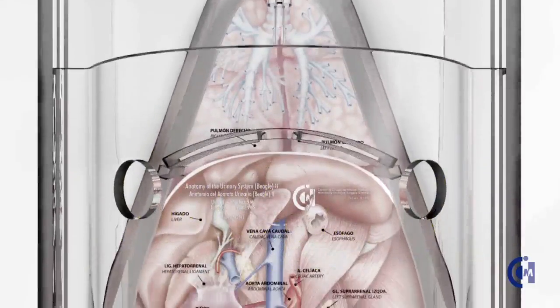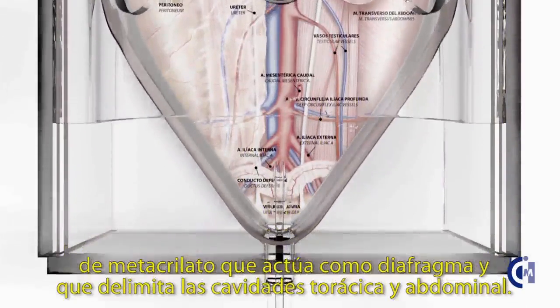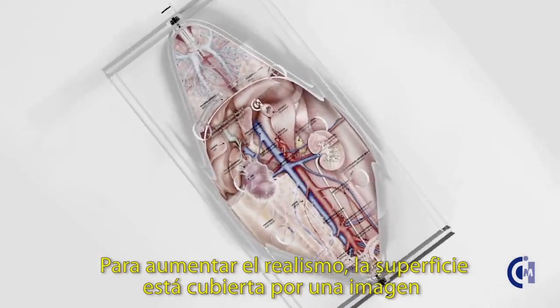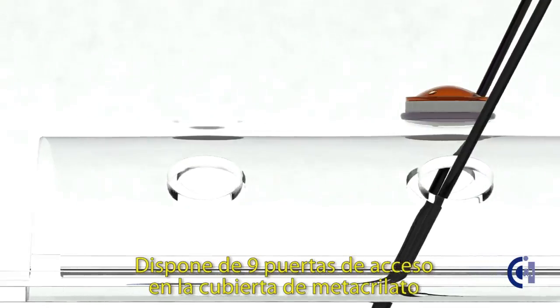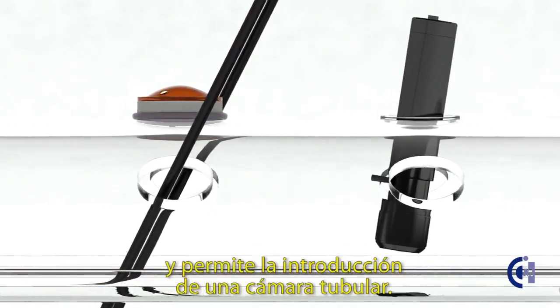The workspace is divided by a curved sheet of methacrylate acting as a diaphragm, which defines the thoracic and abdominal cavities. To increase the realism, its surface is covered by a picture of the abdominal and thoracic organs. It has nine access ports on its curved methacrylate cover and allows the introduction of a tubular camera.